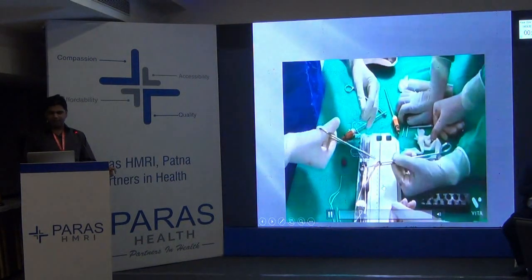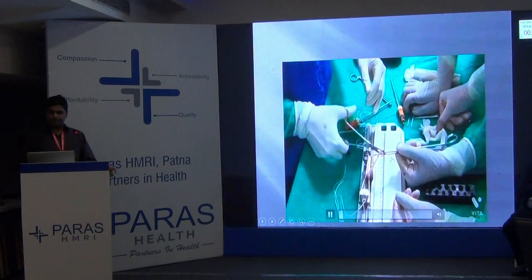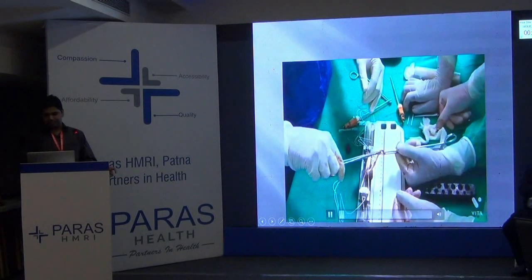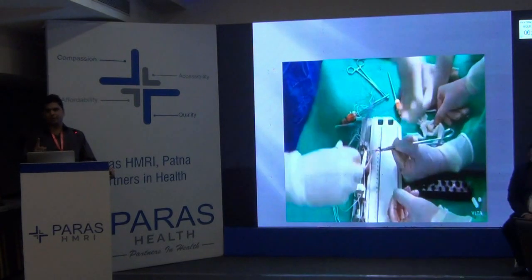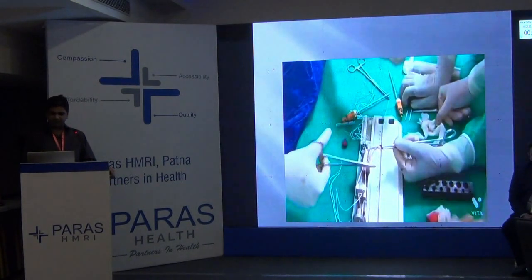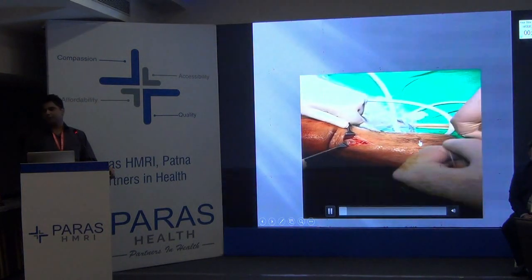So this is how we prepare with a T-button. We use tendon preparation like we do in all inside. We make a closed loop of a quadruple semitendinosus, and this is the cinching video of your T-button.